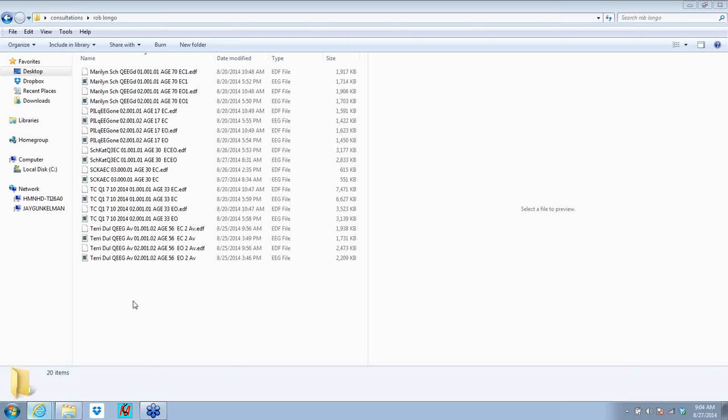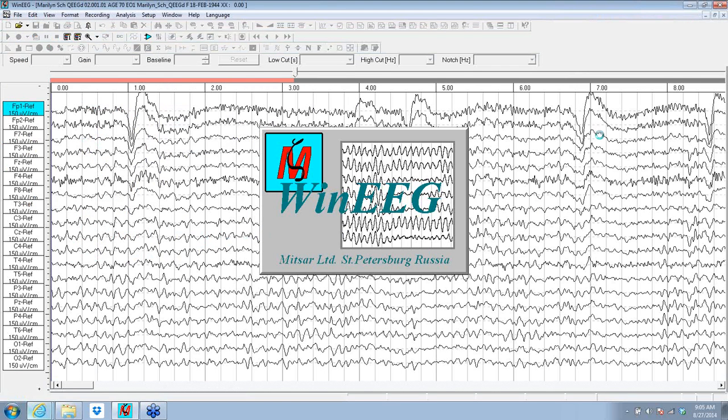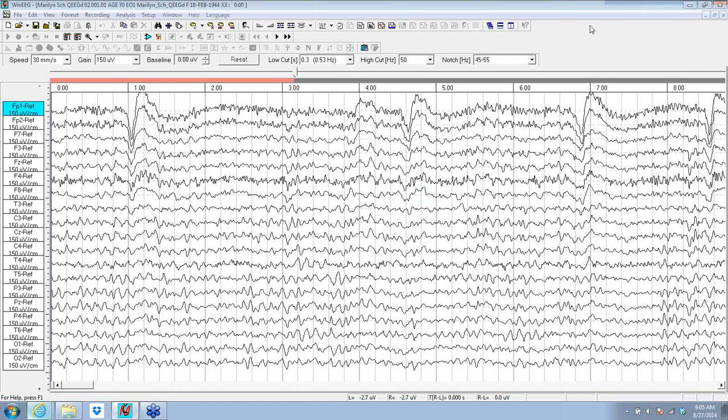So you need to look to the patterns in the EEG and not simply depend on a univariate database to tell you when something's not right. We're going to look at the raw EEGs today. And I always start with the eyes open and take a look at the EEG with the eyes open.